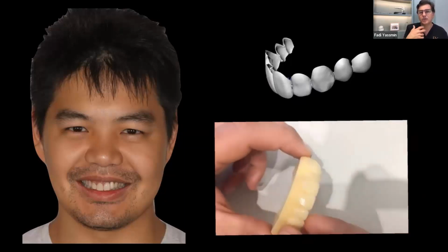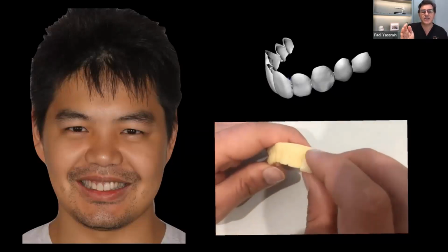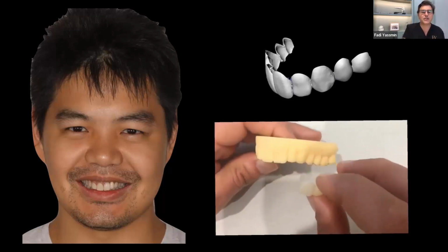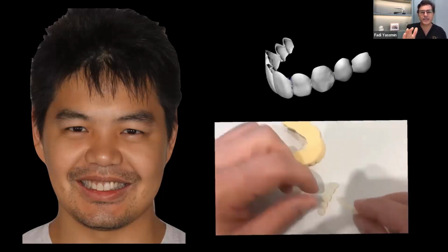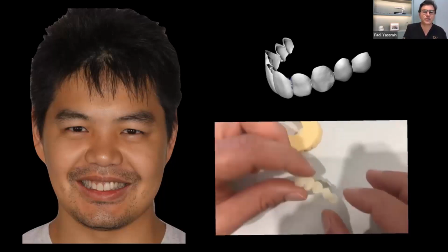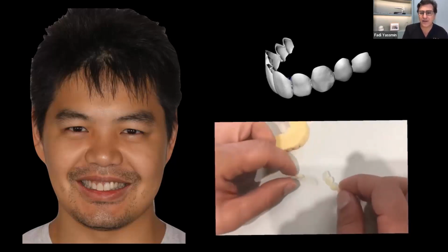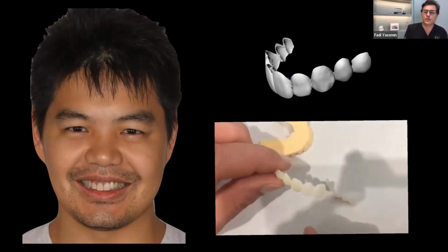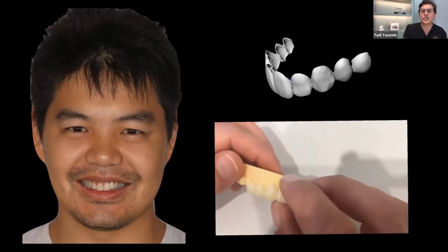Our design was to look at how we could get some gingival harmony with the central incisors, and at the same time replace the crown on the implant, and look at what the options are. We certainly weren't removing the implant. It's been there for years, but what could we do to improve the aesthetics? And using digital smile design and the shell technique, we were able to plan.